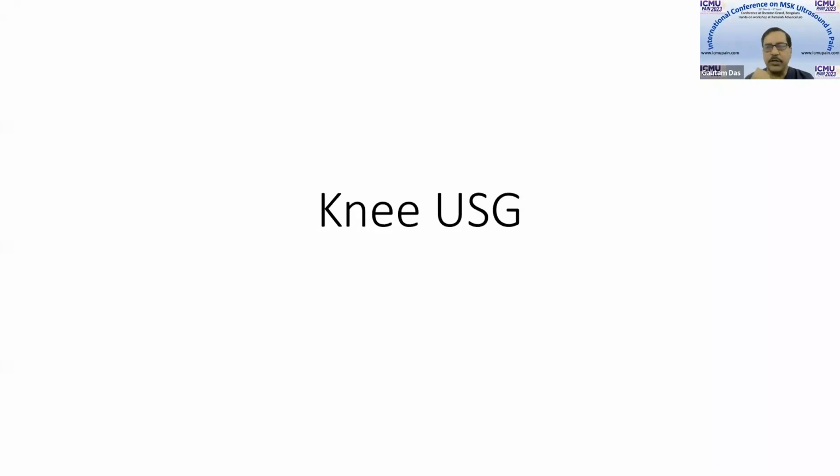So today we'll be talking about the anterior knee, and as I told in the beginning, we will be talking about only the basic things. This class is for those who are very new. Already we discussed that part.